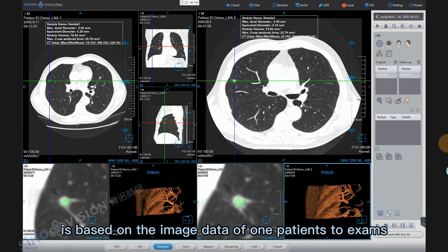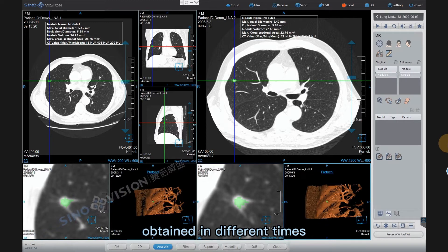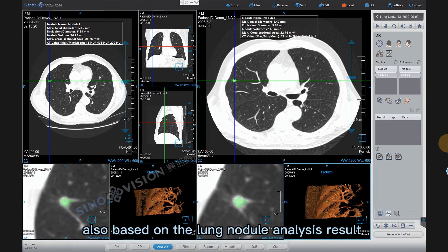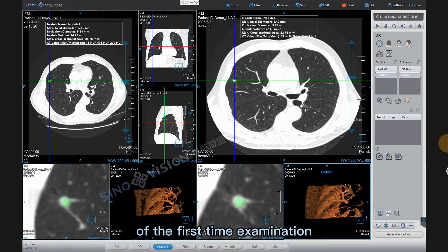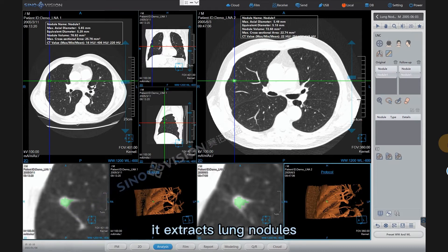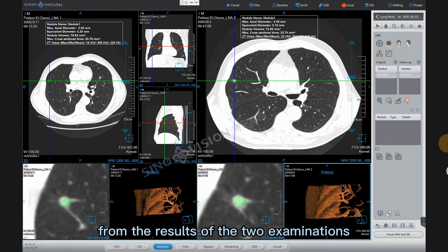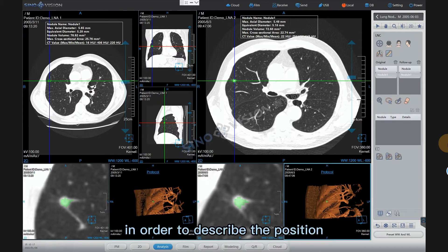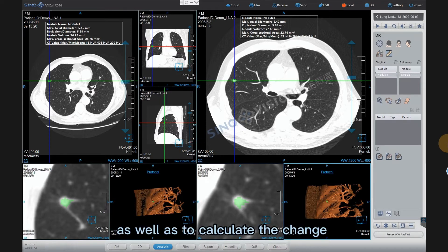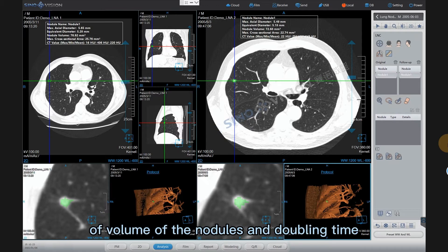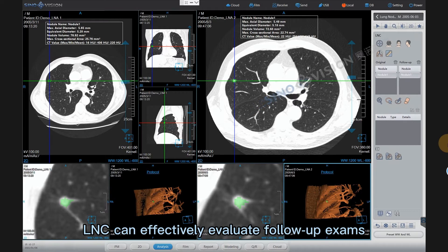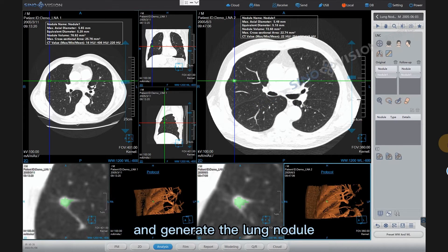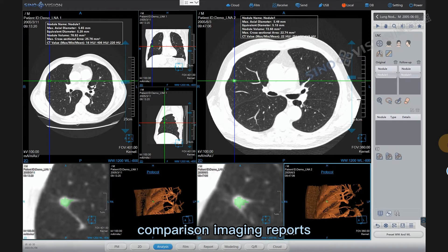The LNC plugin is based on the image data of one patient's two exams obtained at different times, and based on the lung nodule analysis result of the first examination. It extracts lung nodules from the results of the two examinations, matches the nodules and compares them, in order to describe the position and shape of the nodules, calculate the change of volume, and doubling time. LNC can effectively evaluate follow-up exams and generate lung nodule comparison imaging reports.